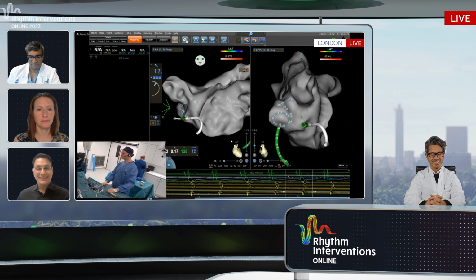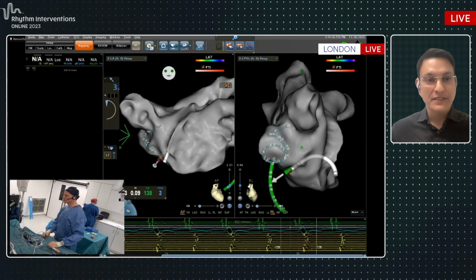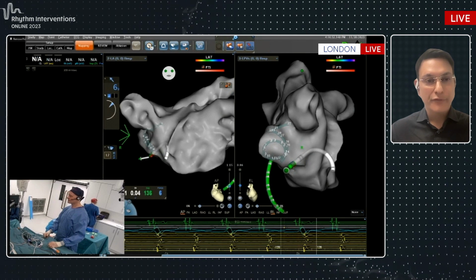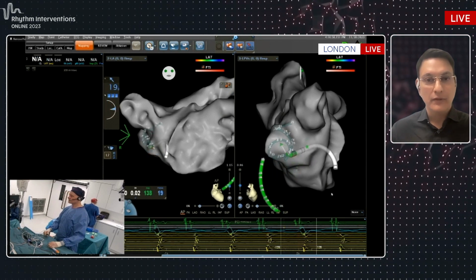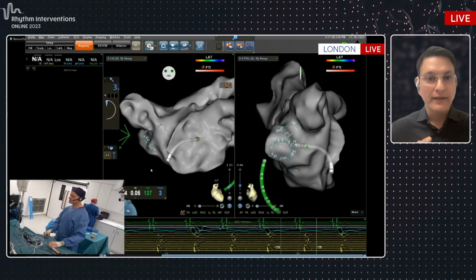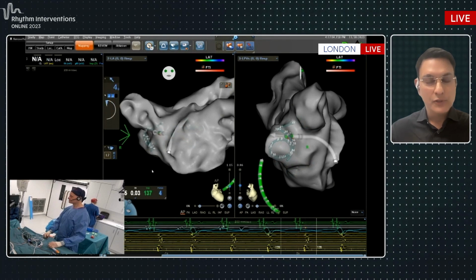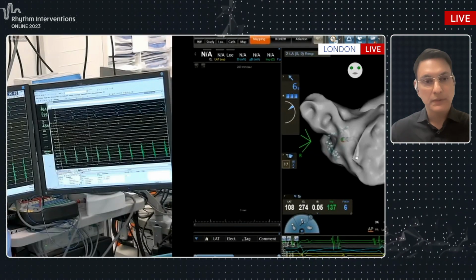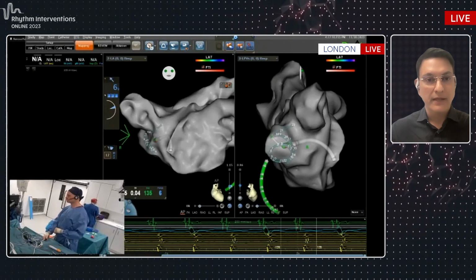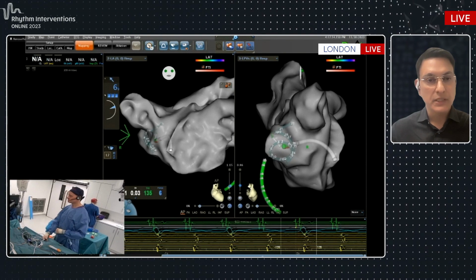Yes, thanks, Julian. It helps that I trained with Richard all those years ago, so it won't be a surprise to anybody that my workflow will be very similar to his. I just wanted to ask Richard whether he's tried entrainment from the proximal and distal coronary sinus electrodes, because I find that quite helpful, not only to look at the activation sequence of the CS electrodes, but also entrainment. If, for example, entrainment is in from both proximal and distal coronary sinus electrodes, then I think it is a perimitral flutter, which could be counterclockwise or clockwise, depending upon the activation sequence.